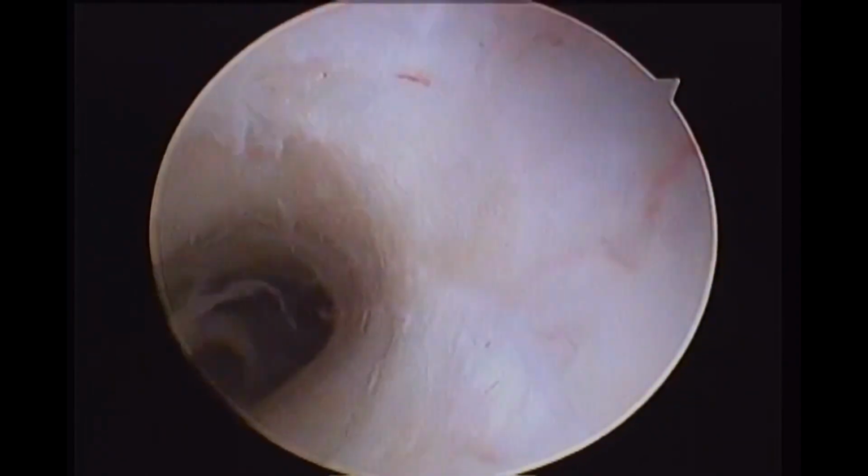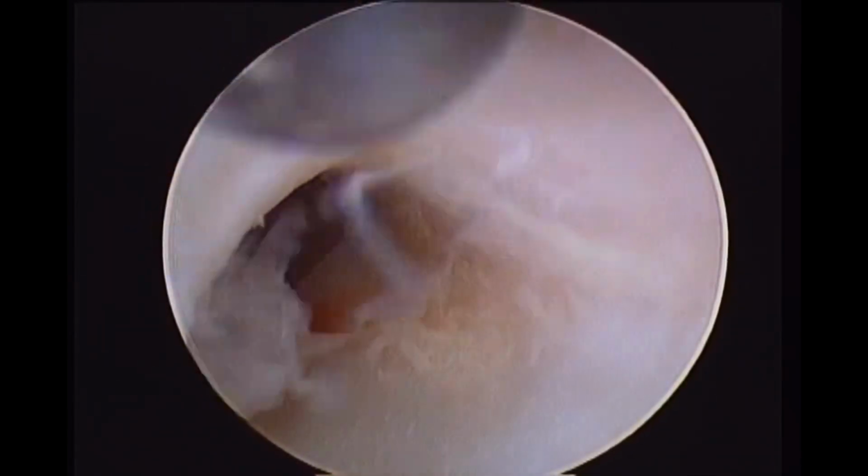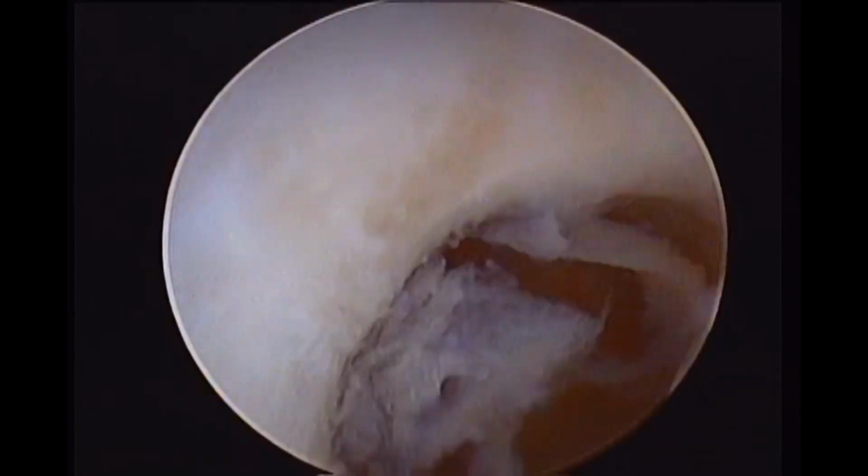That's why the hysterography contrast dye could not fill the cavity and gave the gloomy, frustrating image of zero cavity. So you can share with me how these few moments can change the life of a patient, can change the diagnosis from hopeless to hopeful.